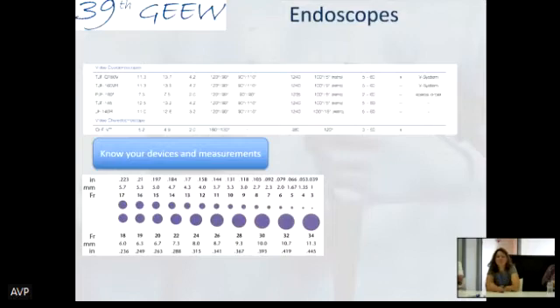So, vision. This is very important because it's very important to know the endoscope. And this is also something young doctors don't really take under consideration, but not everything can go in everything. And we have to know the scope.